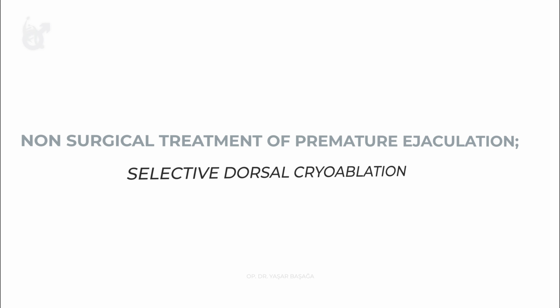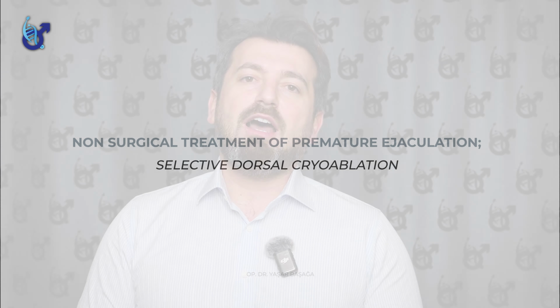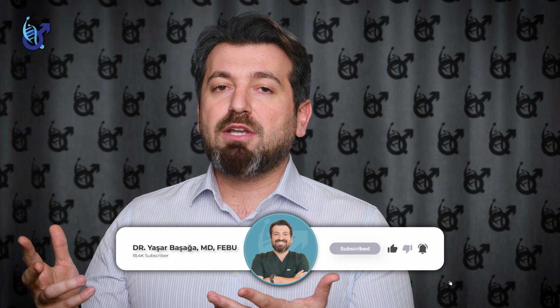Today I would like to talk about non-surgical treatment of premature ejaculation, which is selective dorsal cryoablation. What is selective dorsal cryoablation? We ablate some sensory nerves of the penis, and we are trying to control ejaculation sensation in males who are getting premature ejaculation. This has a similar philosophy to the selective dorsal neurectomy surgery, but this treatment is for the men who are afraid of getting surgery and for the men who are getting premature ejaculation.